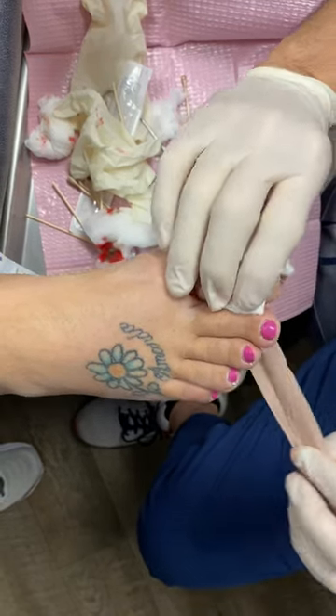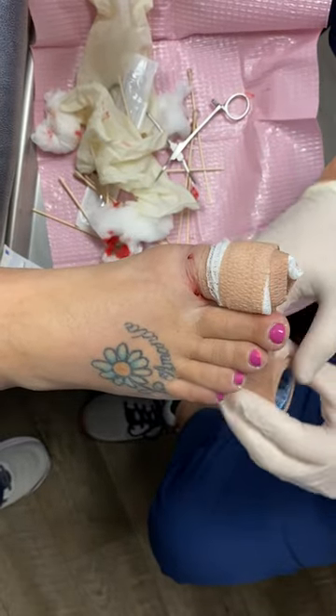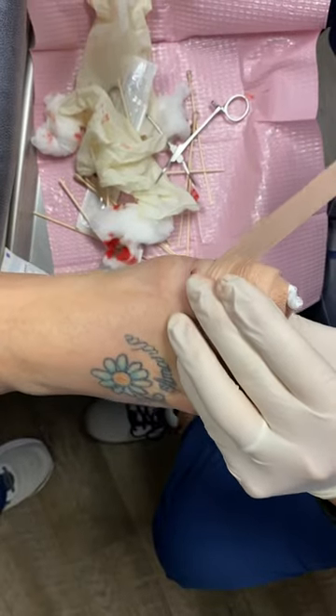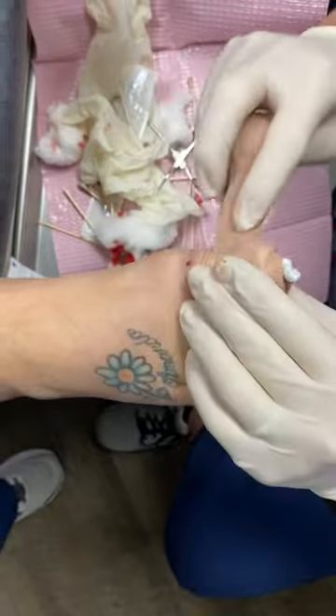It's also very common for these procedures to get very red after, because we burn this with acid. So that is an ingrown toenail procedure, commonly called a P&A — phenol and alcohol matrixectomy. If you'd like to learn more, feel free to visit our website at www.timoniumfootandankle.com. Thank you.